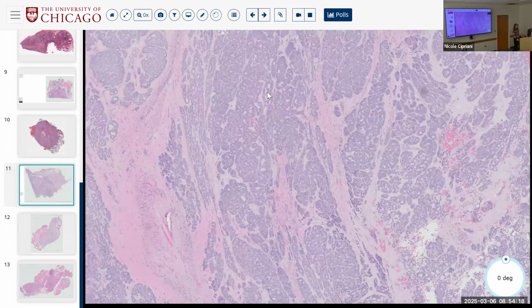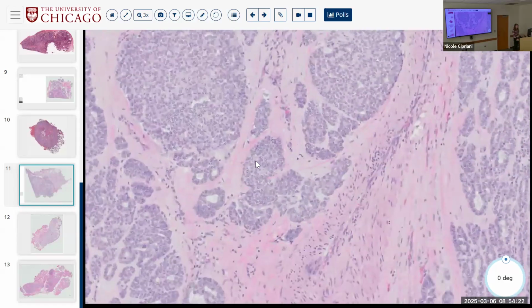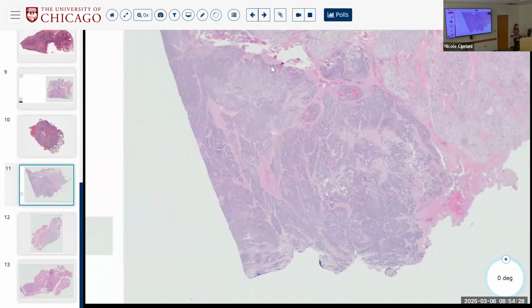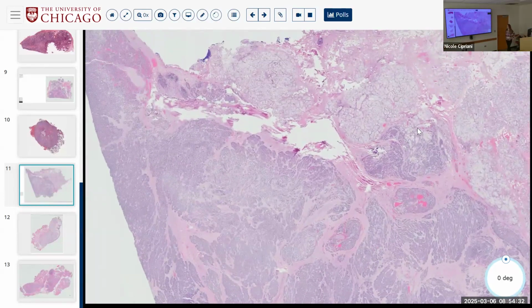So what is your differential diagnosis here? Polymorphous adenocarcinoma versus adenoid cystic carcinoma. In this case, you would not be considering a benign thing like a pleomorphic adenoma. So throw your three stains on there: P40, c-KIT, S100. P40 negative or positive?